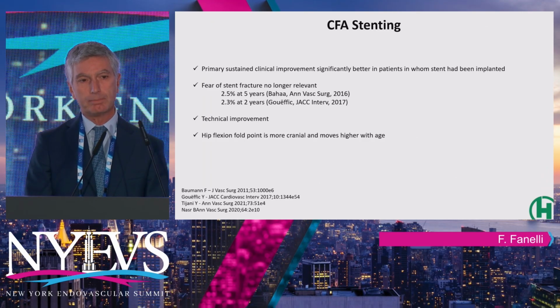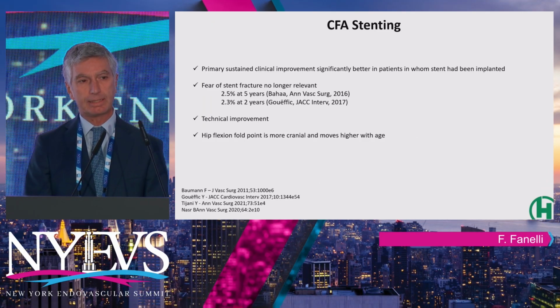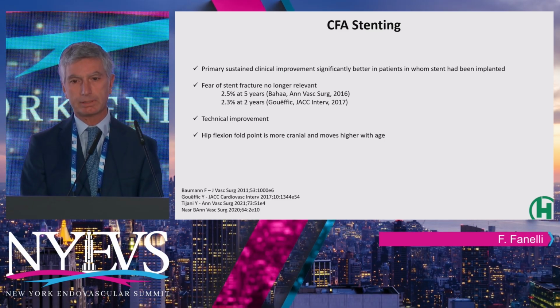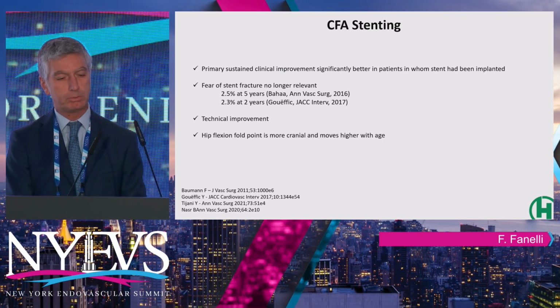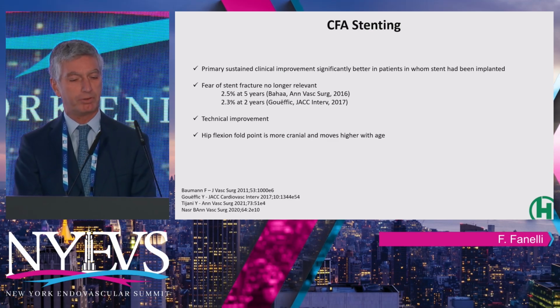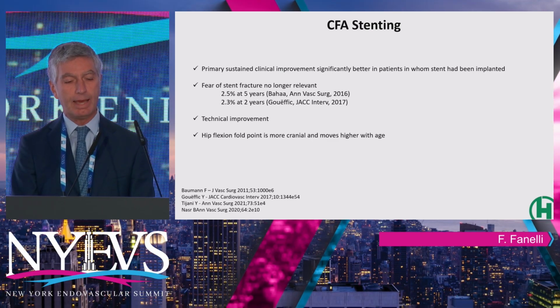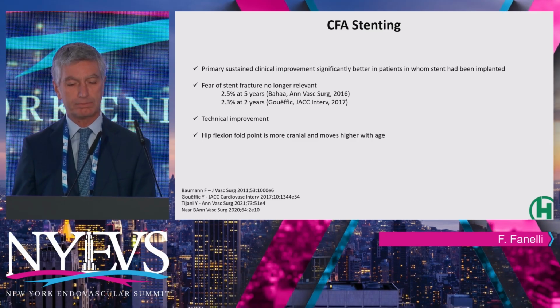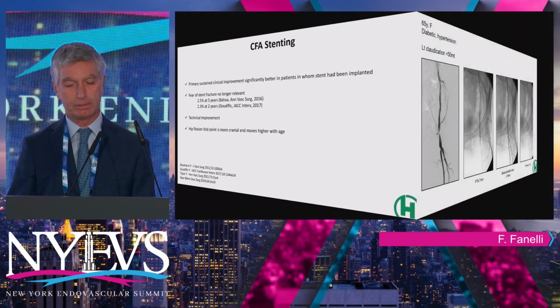Obviously, when we talk about stenting in the common femoral artery, there are some debates regarding the patency rate and the fracture rate, but you can see it is reported in the literature to be very low, 2.5% at 5 years. And also this is thanks to the technical improvement of the devices that are now available.